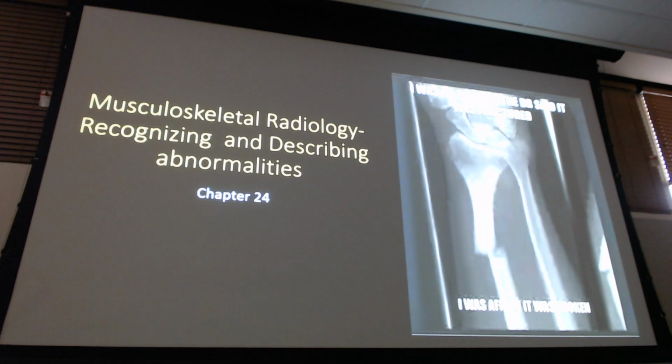We're going to talk about it more when we get to the upper extremity. What I'm looking for is, does the fracture within the scaphoid show up more after that one week? As soon as I see that, they get the ortho referral because they need to be evaluated for surgery, because we're trying to prevent avascular necrosis. The pictures I'm showing you that show the sclerotic areas and the avascular necrosis are scaphoid fractures that were missed, and that's what it leads to.